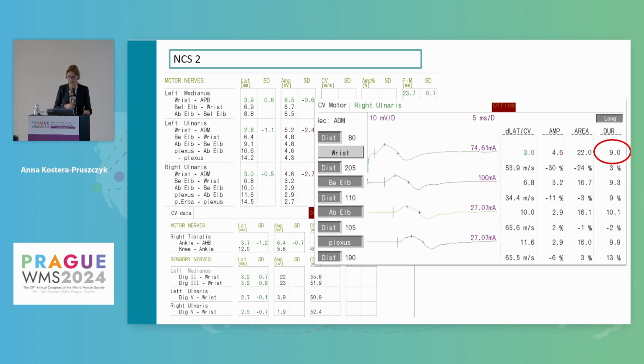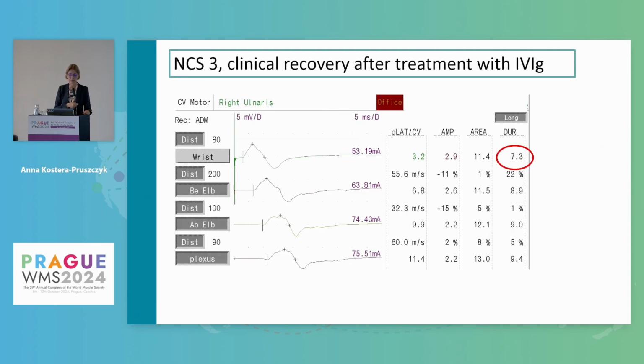She had increased protein in her CSF and was treated with IVIG with a preliminary diagnosis of purely motor CIDP, and after treatment she made a remarkable recovery, but there was also improvement in her neurography pattern, with the duration being normal after the IVIG course.